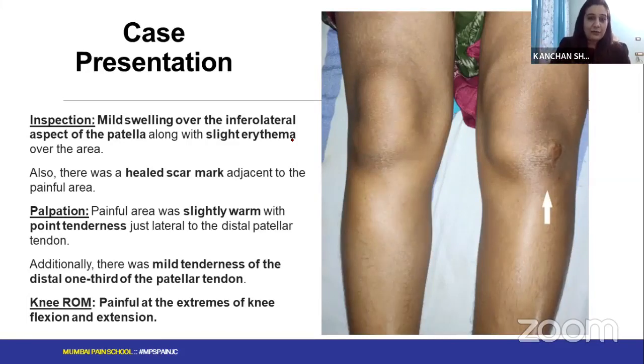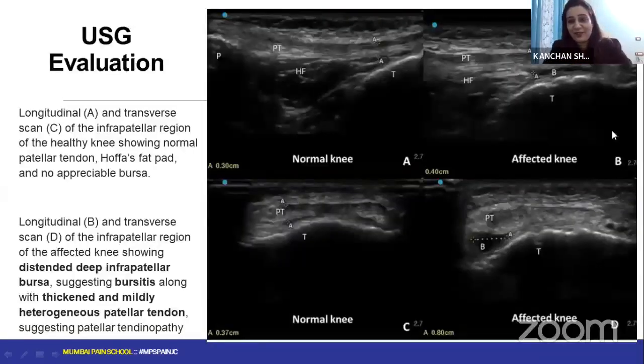But I feel it is not more of a tendinosis, it's a partial tear, because one whole layer of the patellar fibers, they are not visible to me very nicely. So I think the picture is not very nice. Not the short axis you just showed me. See, it's all gone here. I'm not able to see. So it is not a very good image to comment on, I should say.